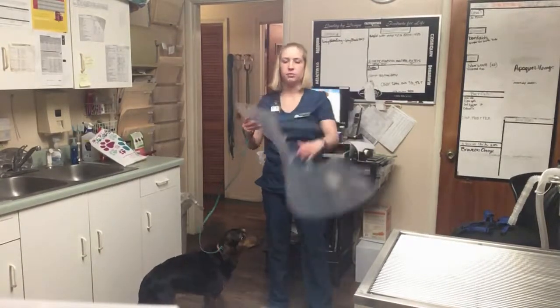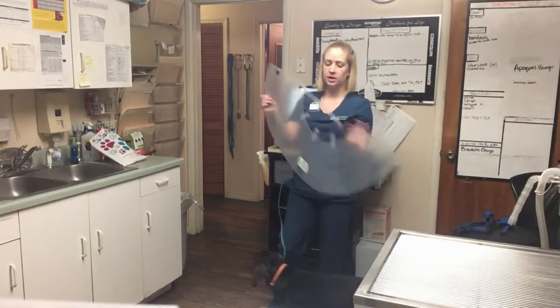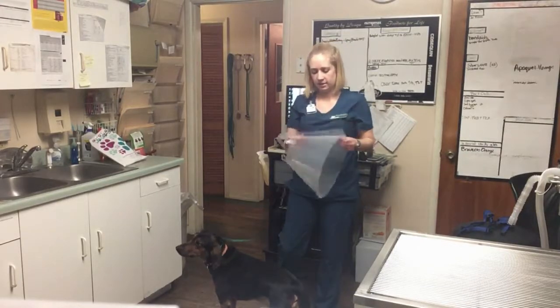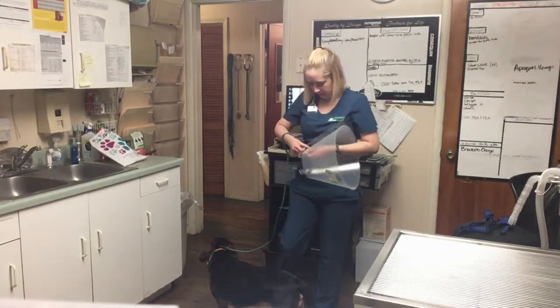So for this one, it has little loops at the end that I've already set up, and this is where the collar will go. So I'm going to go ahead and get this one set up for Mr. Rudy today.